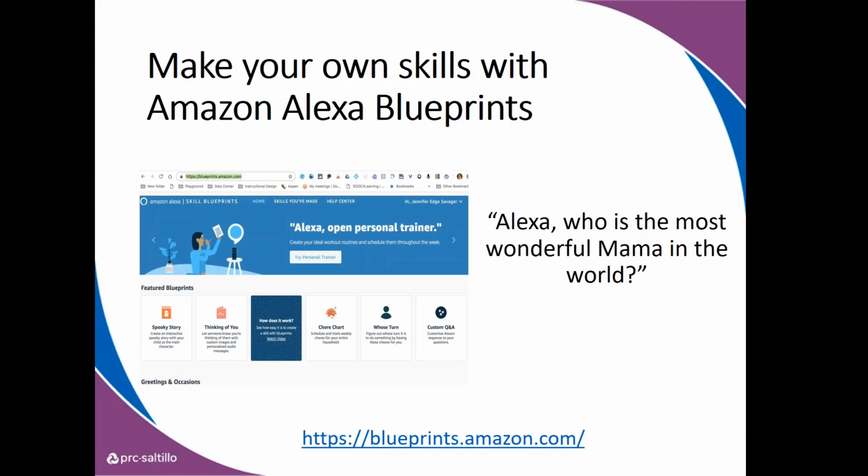So think about things your AAC user might want to ask, and then what you would want her to respond. It could be, Alexa, what are my chores for the day? And Alexa could tell back. Or, Alexa, I program Mother's Day's coming up, folks. Alexa, who is the most wonderful mama in the world? And you type an answer. Well, your mother, of course. Jennifer's the best.